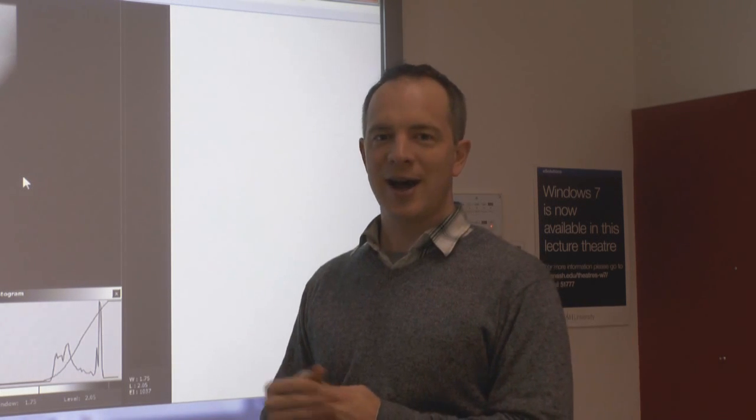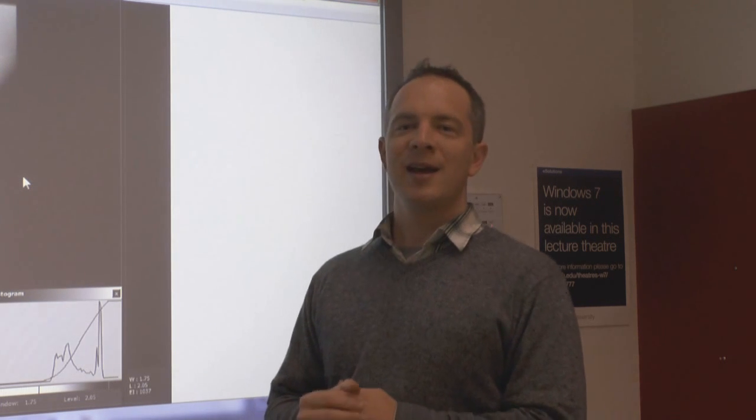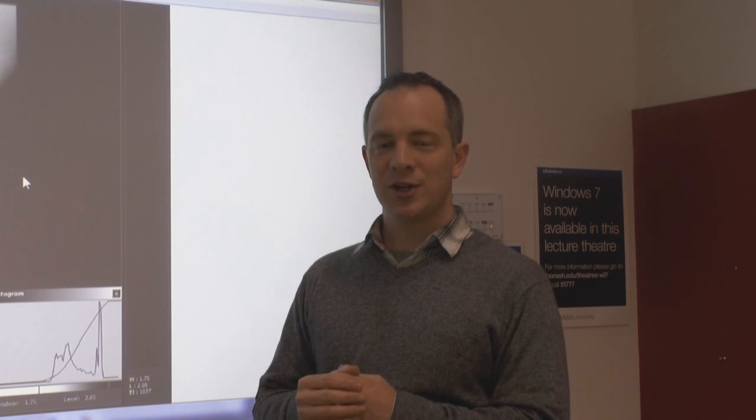So the main focus of the experiment now is to look at how exposure index changes with mAs and kVp. Now hopefully you remember from lectures how the mAs changes the exposure to the patient as well as to the detector, and that there should be a linear relationship between mAs and your dose to the patient. kVp, however, is a lot more complicated. Changing the kVp changes the energy range of your X-rays. It also changes the number of X-rays produced and also changes the dose distribution.